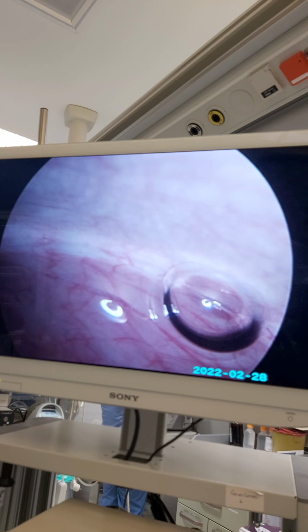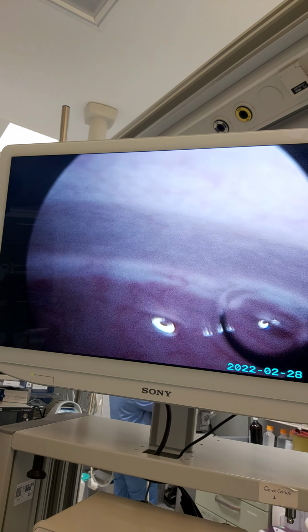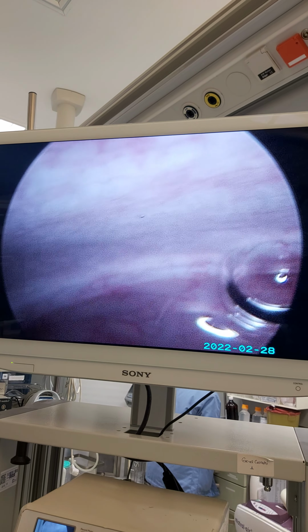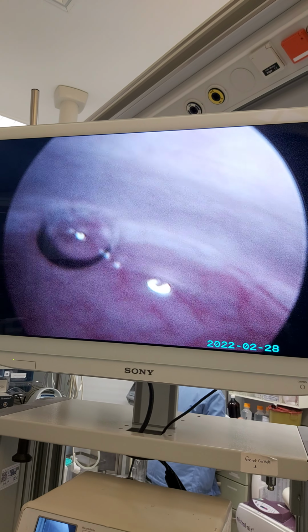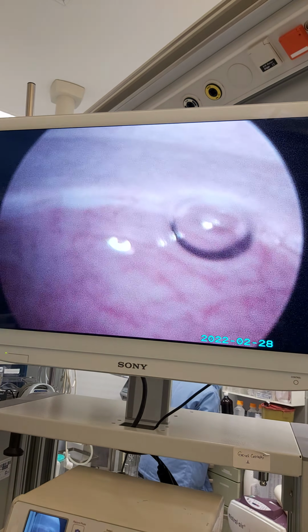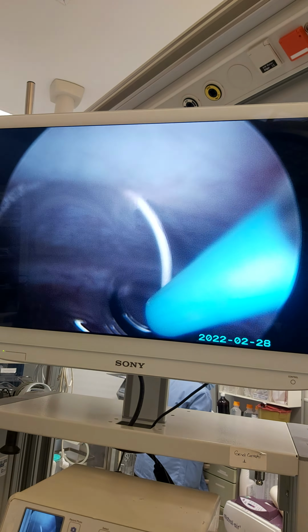Yes, and in the ultrasonography before the procedure, we also noticed some white plaque-like tissues in the front wall of the bladder. Here I can see also abnormal tissues spread in the front wall. So I will make some fulguration here. Look at these tissues.